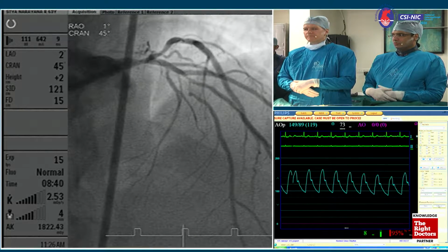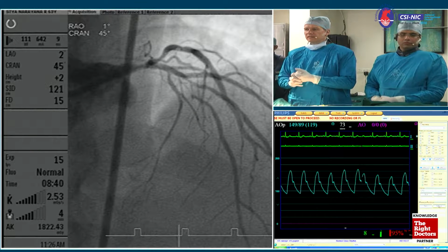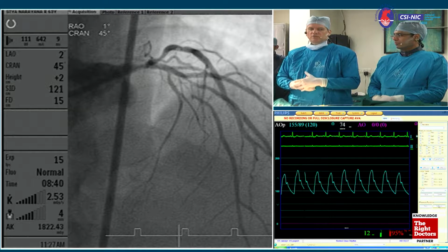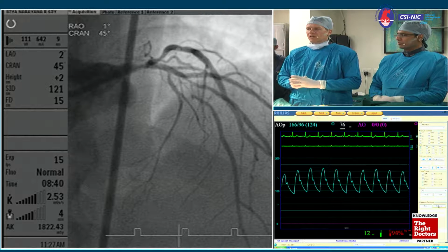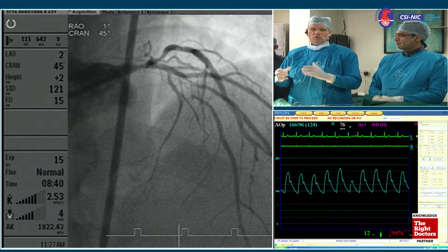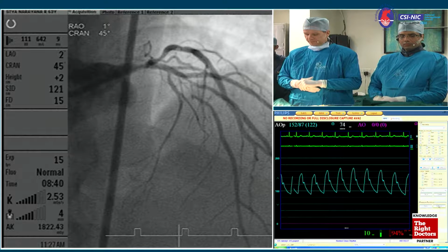So our target today is the full left coronary artery. We will not treat the right today. This will be done later on. The question is now on the strategy. If you want, I can take you into our strategy, or you can have a short discussion, whatever you like.